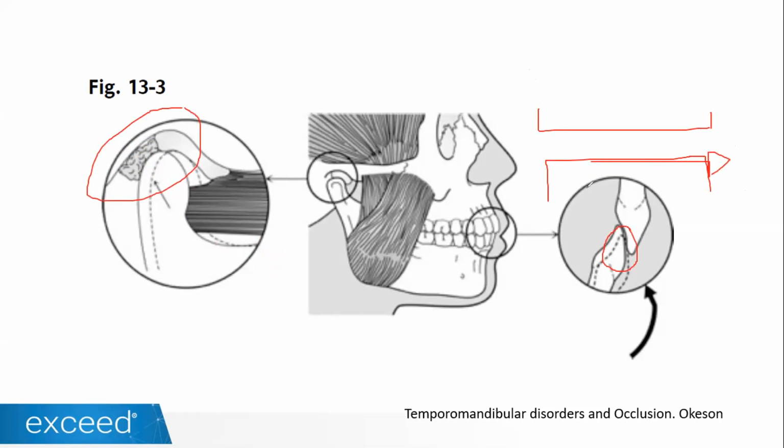So this just opens the vertical dimension. The patient gets an improvement of the TMJ issues, but the mandible displaces forward a little bit because, well, it can move towards any place it wants since there are no occlusal contacts in there. So it can just go to the more relaxed position. So what happens is that in a lot of situations where we have a very tight overjet or even an anterior crossbite, this can get worse. We can even generate an anterior crossbite because of that.